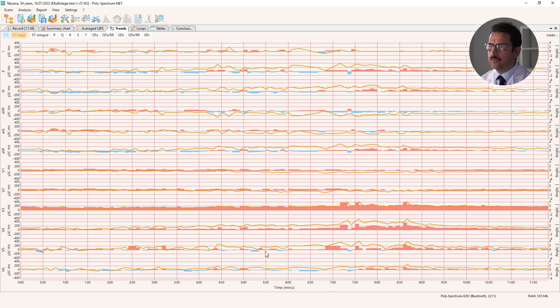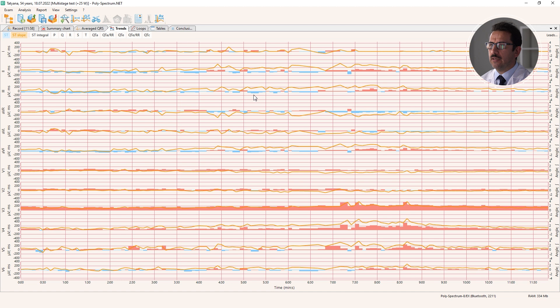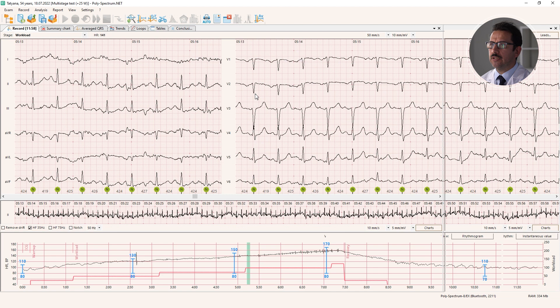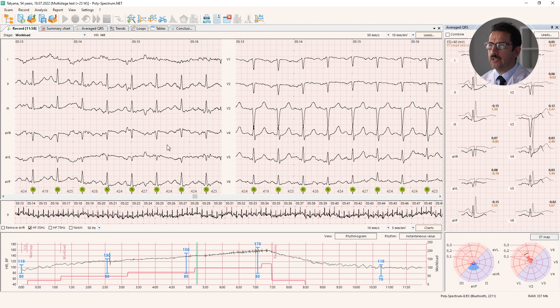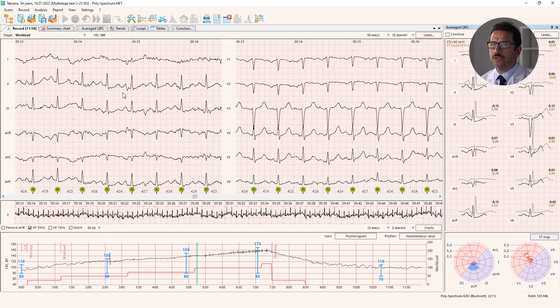Upsloping ST depression may be just an overload artifact in patients with high blood pressure or in trained persons, so you should pay more attention and be more cautious interpreting upsloping ST depression data. Here I see a part that may be suspicious for depression, and if I want to check if it's real, I can double click on that part and the software will transfer me to the native ECG.